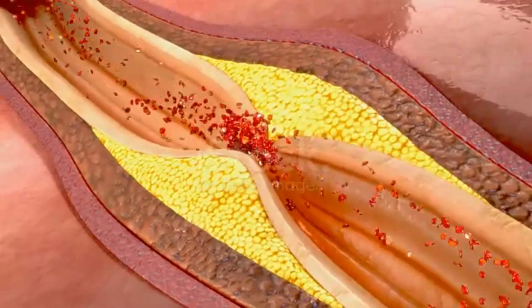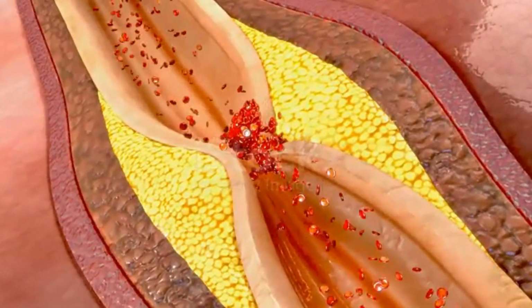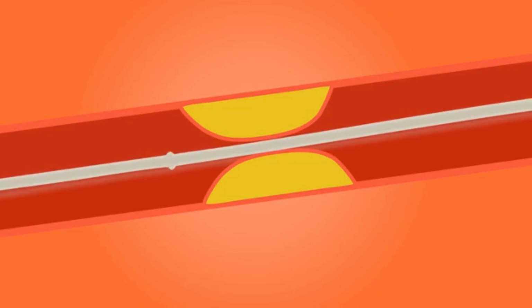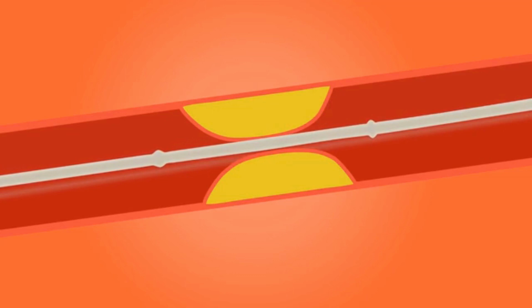If they find narrowing or blocking of the blood vessels, they may be able to treat it immediately via the catheter, such as by placing a stent to dilate and keep open the blockage. They will discuss it with you first so you can decide whether to give permission at this point.